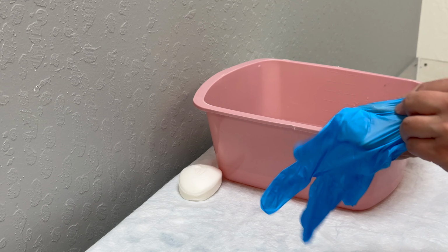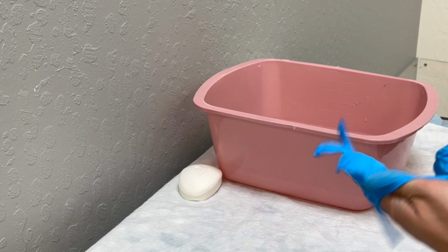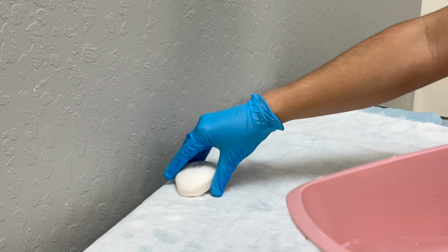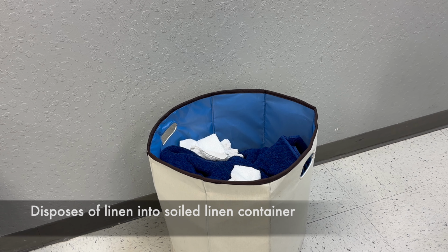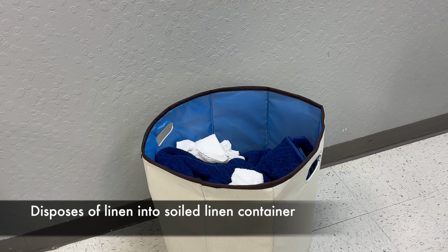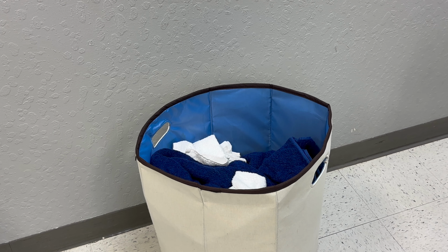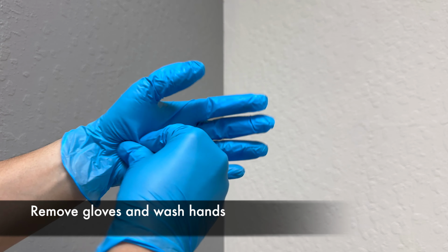Put on another set of gloves to clean up supplies. Disposes of used linen into soiled linen container and disposes of linen protector appropriately. Avoid contact between candidate clothing and used linen. Remove gloves.